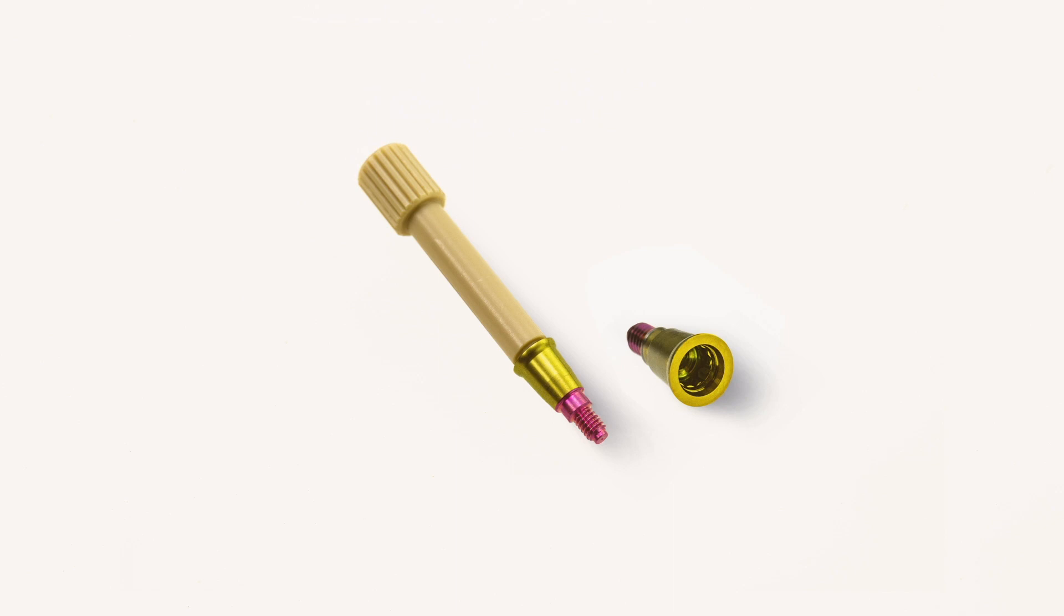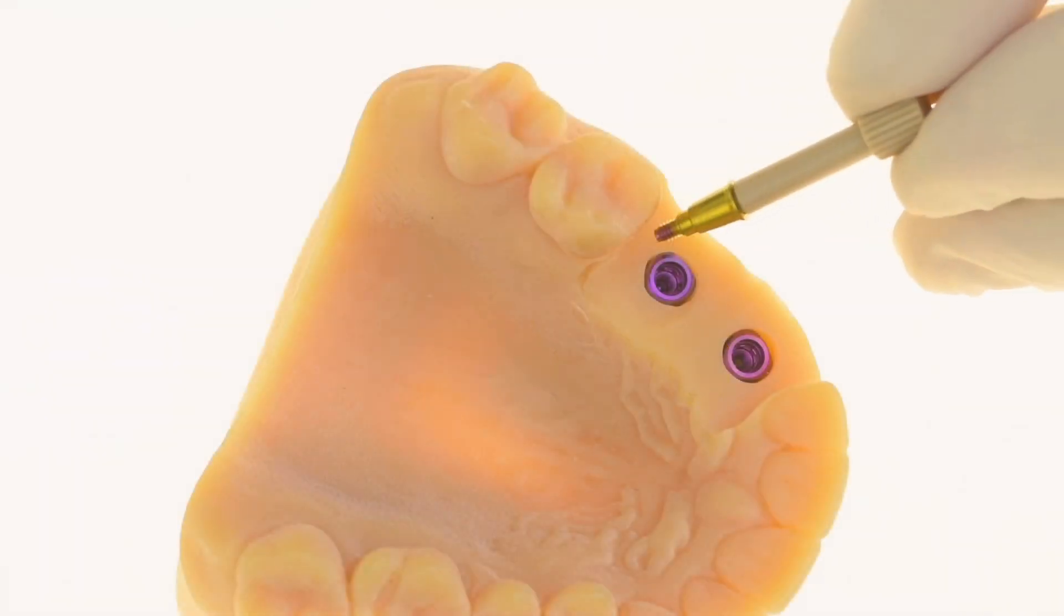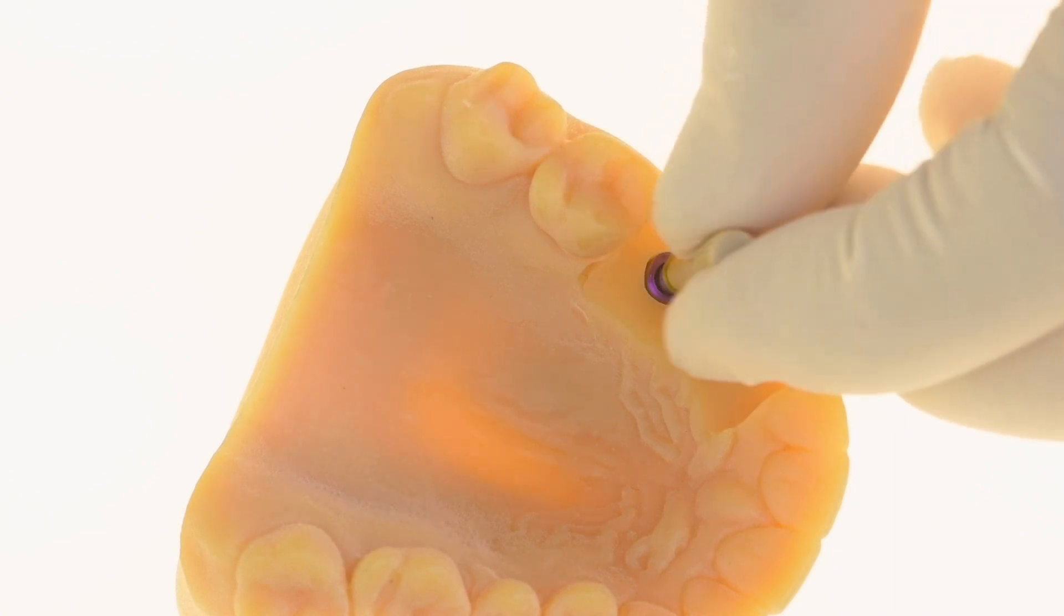The MIS Connect abutment system is a one-time solution which enables avoiding interference of the peri-implant gingival seal. We start by screwing in the Connect abutment to the implant using the plastic gripping tool and remove the tool with a slight side-to-side bending motion.